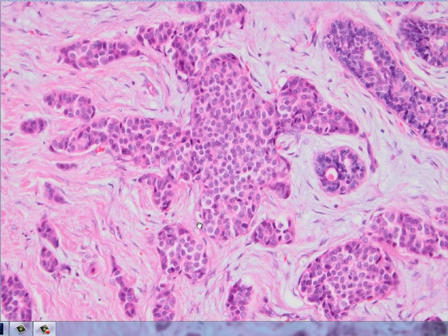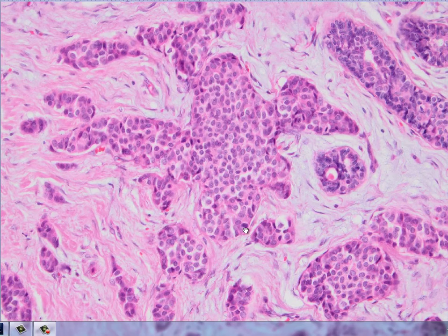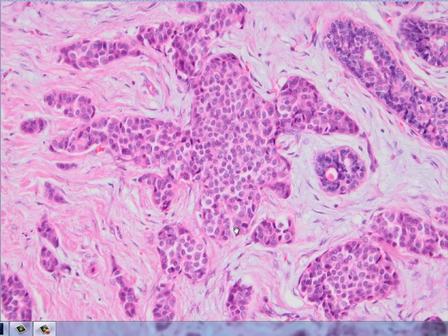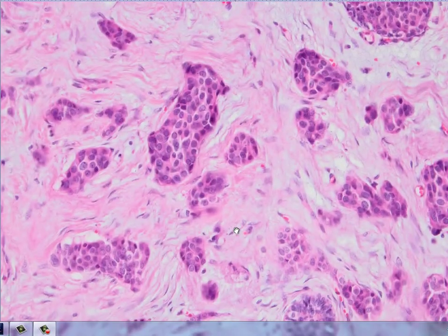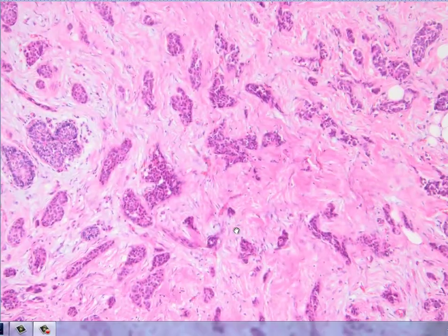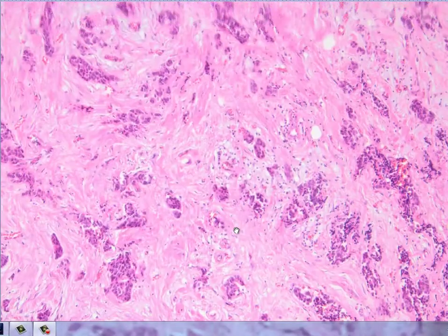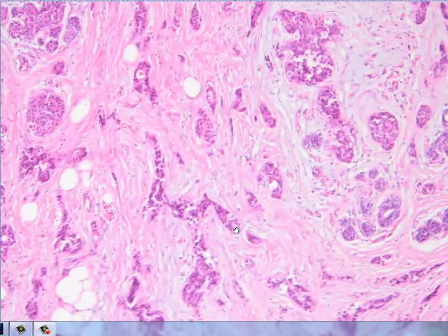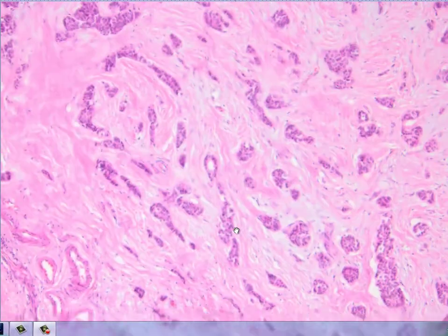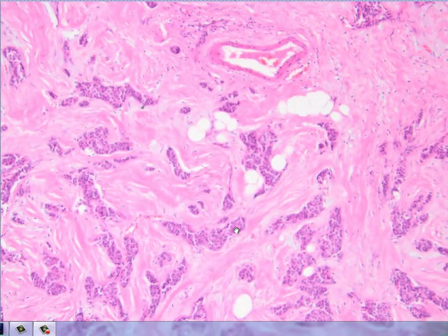When we do the synaptophysin and chromogranin staining, the cells stain diffusely, and we call this a neuroendocrine tumor. But today's topic is not the diagnosis or the type of this tumor — the tumor looks well differentiated.